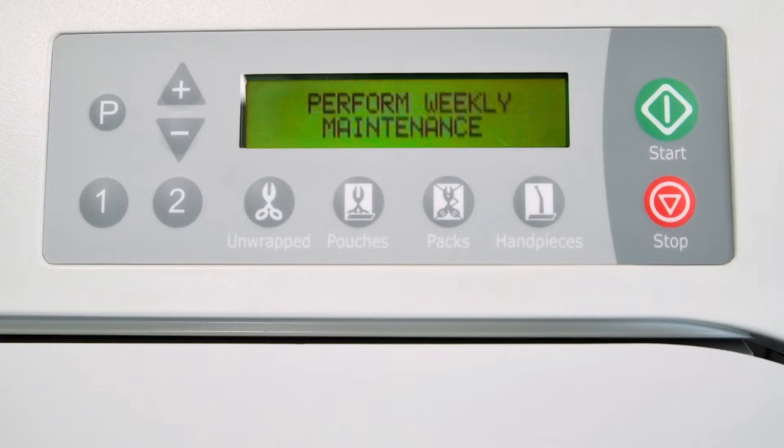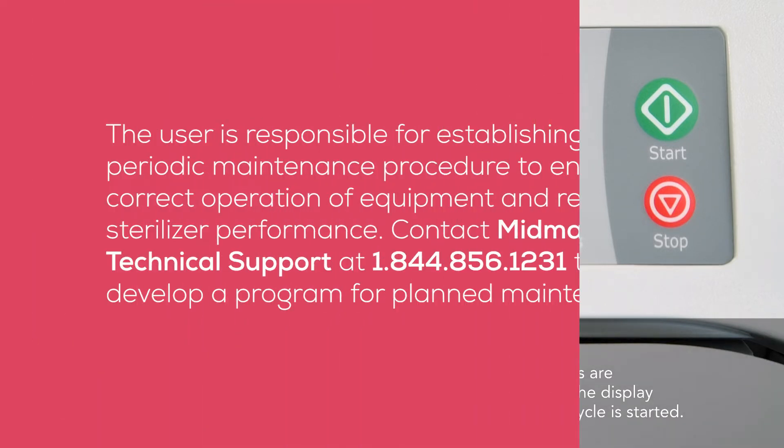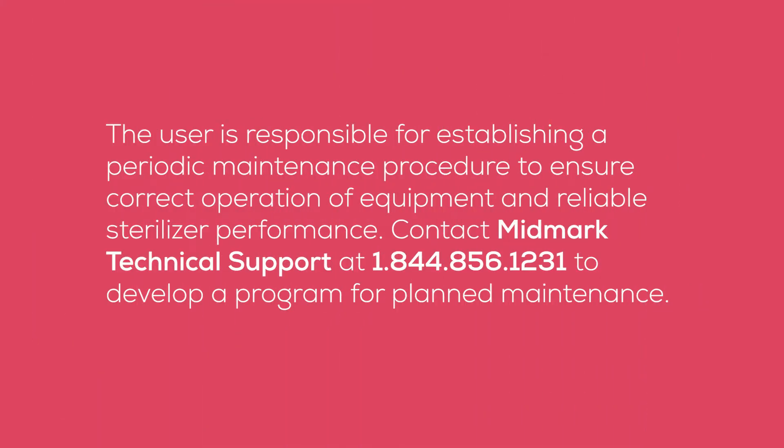Maintenance reminders will be briefly displayed on the screen at the appropriate intervals when a cycle is completed to remind the operator that maintenance needs to be performed on the sterilizer. These reminders are removed from the display screen once a cycle is started. The user is responsible for establishing a periodic maintenance procedure to ensure correct operation of equipment and reliable sterilizer performance.